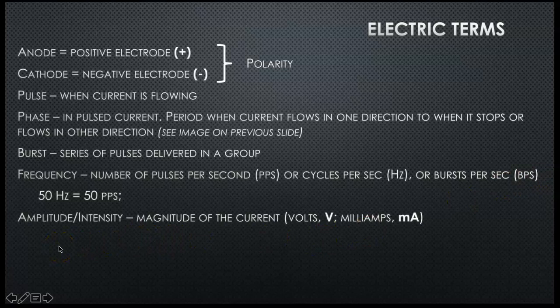The amplitude, when you're turning up the intensity of the electrical stimulation, it's the magnitude of the current. It's like how strong it feels. It's usually measured in volts or milliamps. It just depends on the machine you're looking at.